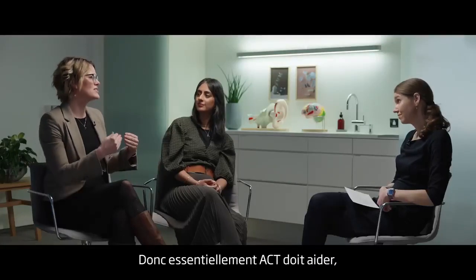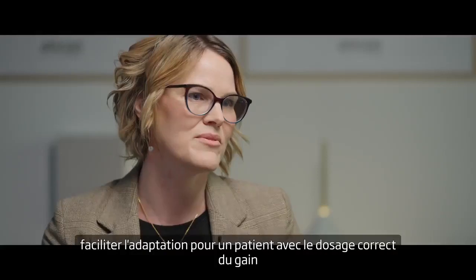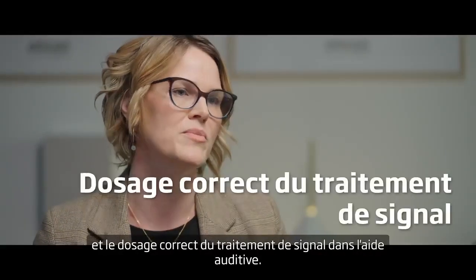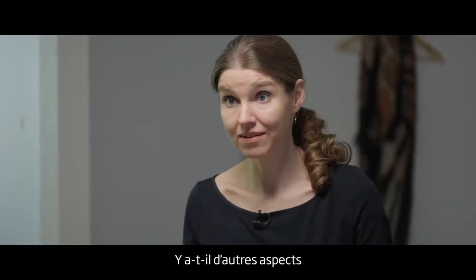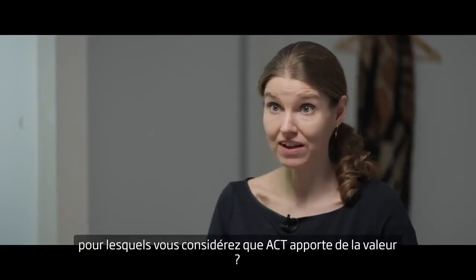So in essence, it should help us make it easier to send a client out with the correct dose of gain and the correct dose of help from the hearing aid. Yeah. So a better first fit, all in all. Absolutely. Are there any other aspects of the fitting where you see ACT as providing value?